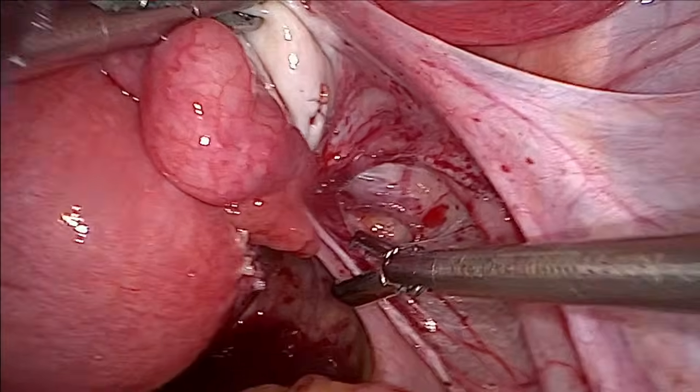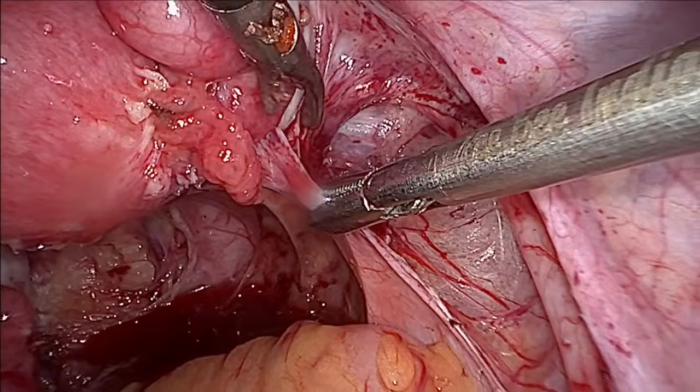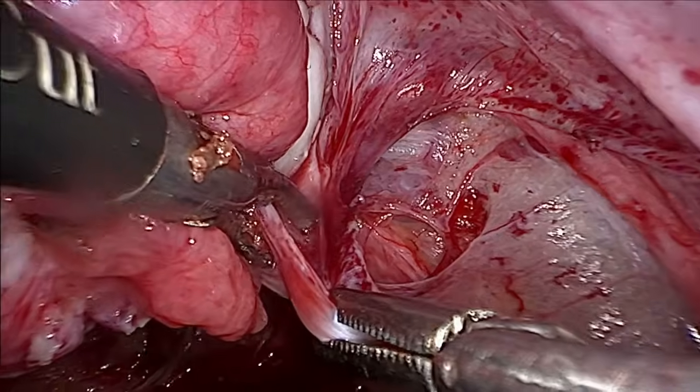Yeah. Okay, so now, yeah, so this adhesion is there, na? Here, yeah. So what I can do is release this adhesion.